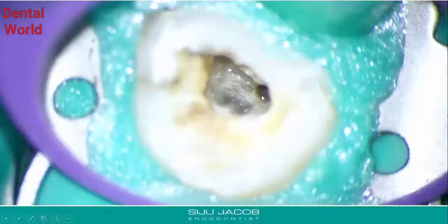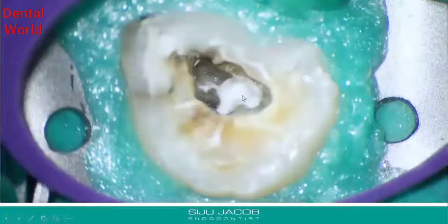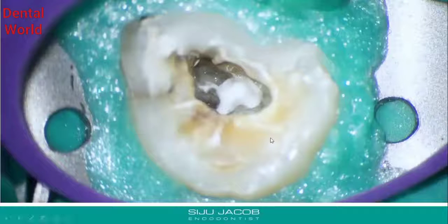So once you locate a canal, the next job is to find out where to look for any additional canals, if there are additional canals, or is it just the one canal? I'm not really sure at this stage. So what I did was I put calcium hydroxide into the canal which I already found, and I put a temporary filling and decided to take an inter-appointment CBCT.